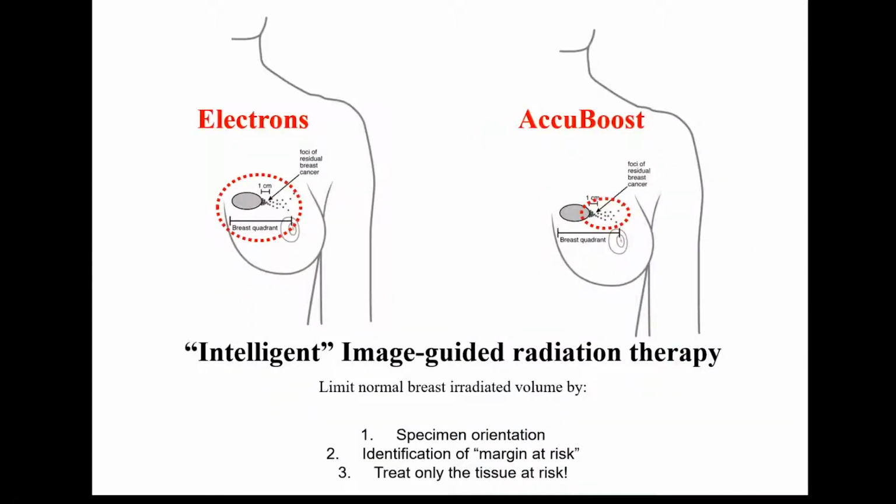But another big advantage that we have found with the use of AccuBoost is being much more selective in how we direct the boost dose to reduce the volume of tissue being exposed to high dose. Next slide.